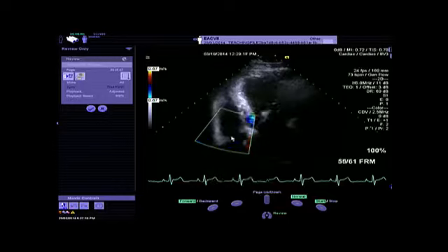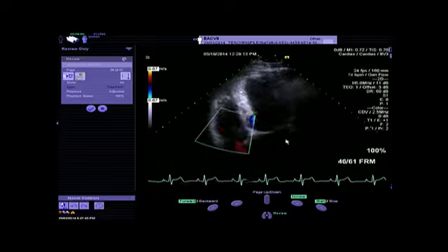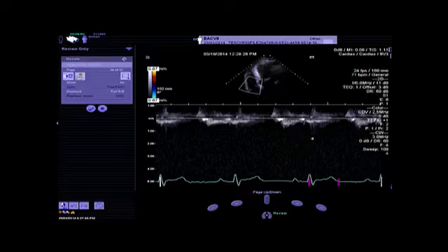And here you have the color Doppler, and you have the tricuspid annulus and the tricuspid valve, and there is no significant regurgitation here. I will try just to measure if there is any, because even if you don't have any color flow, you should try with the Doppler signal to get any regurgitation that you have missed with the color flow, to have an idea of the transtricuspid pressure gradient. And clearly in this patient, it's impossible to get this information.